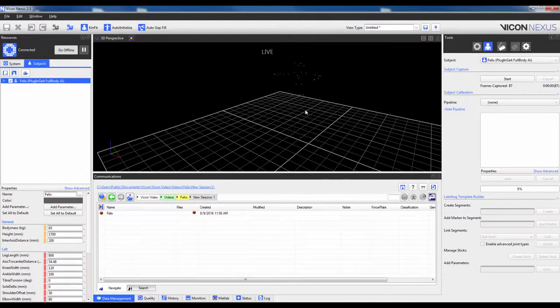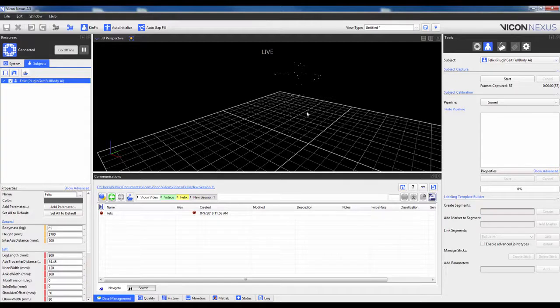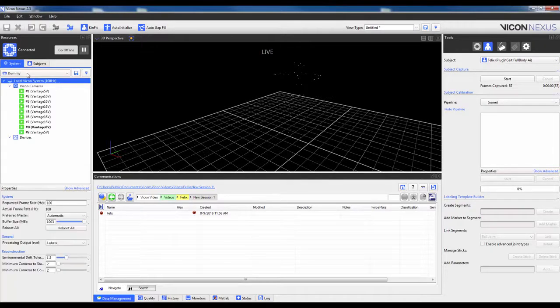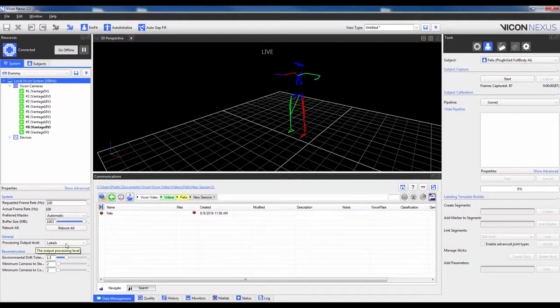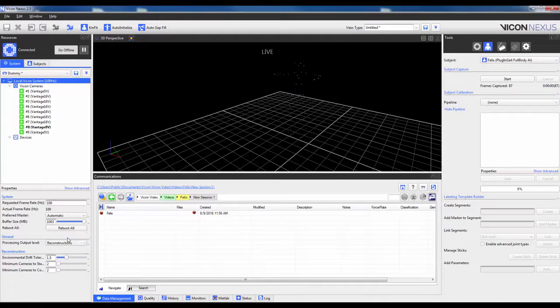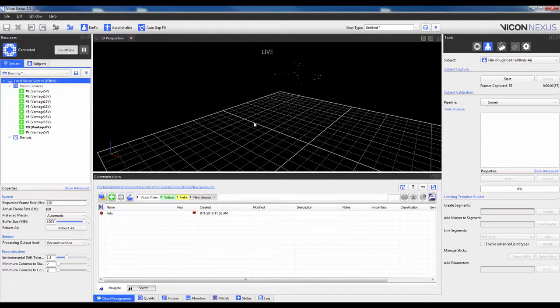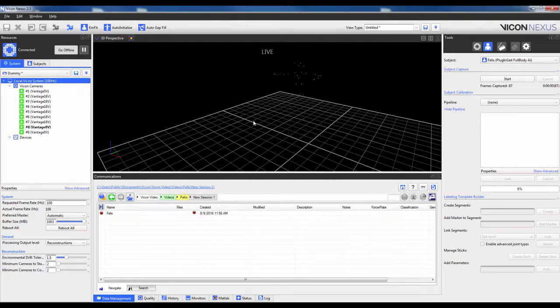Sometimes the software will try to label the subject by using the existing template. If this makes it difficult to see the markers, navigate to the System tab, click on Local Vicon System, navigate down to Processing Output Level, and change Labels to Reconstructions. Just make sure to change it back for the Dynamic Trials if you wish to see real-time labeling. This is something I will do later in the video.